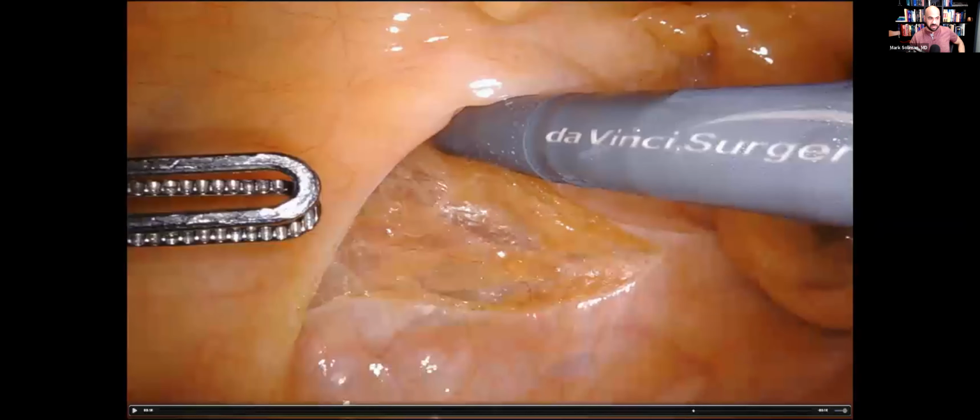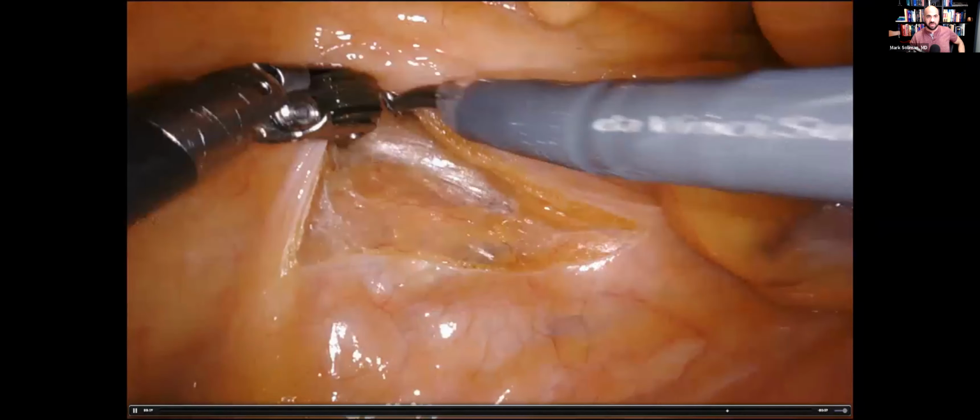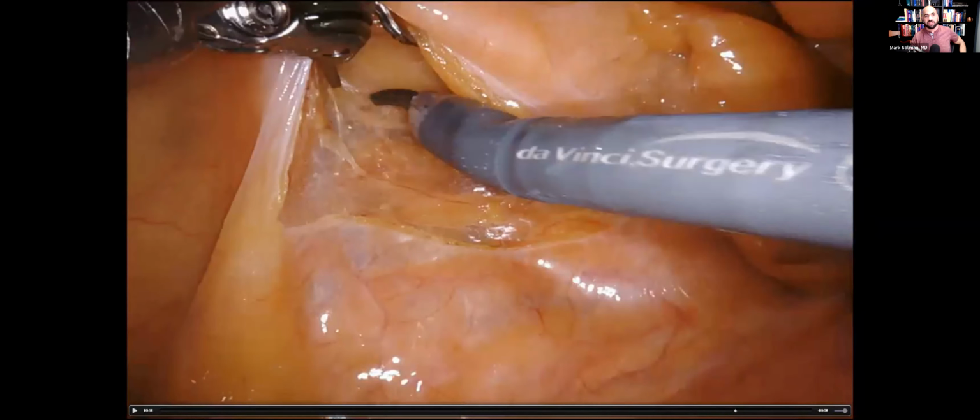Look at my left hand. Left hand's going to, in that incision point, I'm going to go in. I'm going to poke, spread, and lift. And look at that right there. Look at my left hand. What it's doing is it never wants to grab. The second you grab something, just assume it's going to rip it.